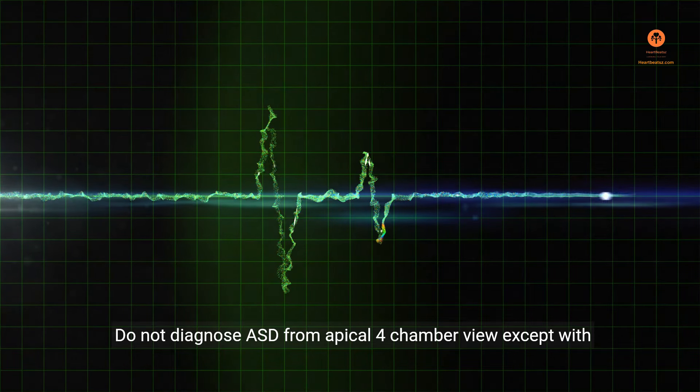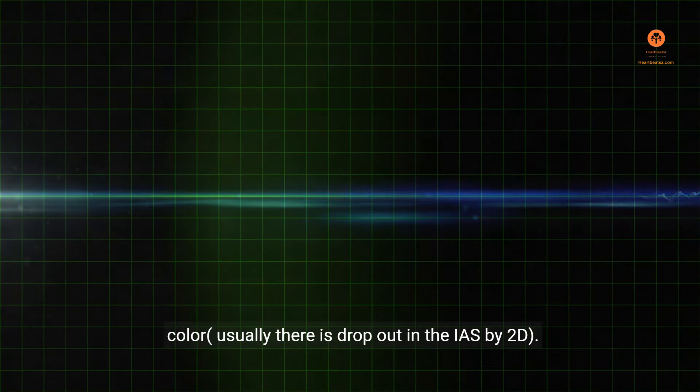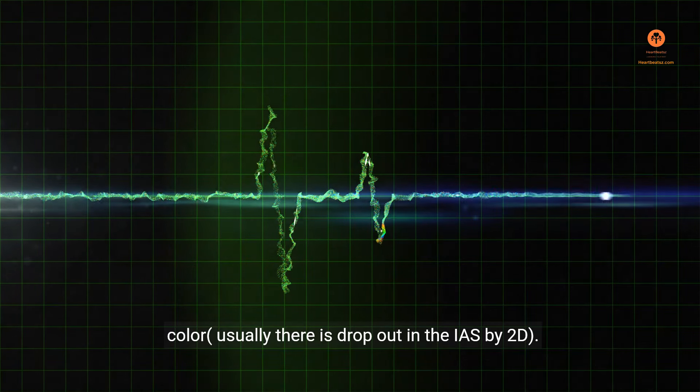Do not diagnose ASD from apical four-chamber view except with color. Usually, there is dropout in the IAS by 2D.